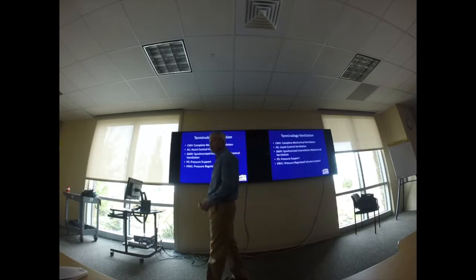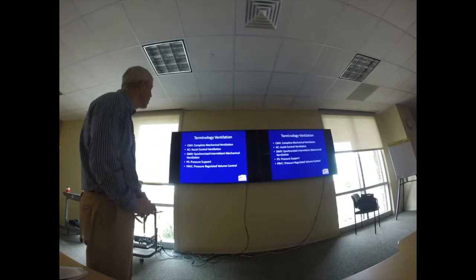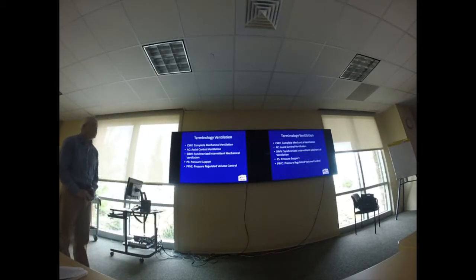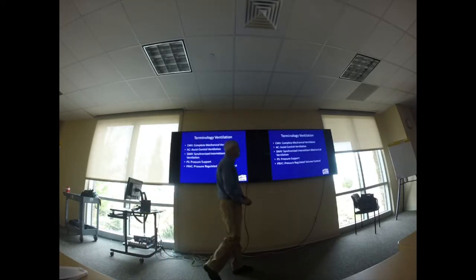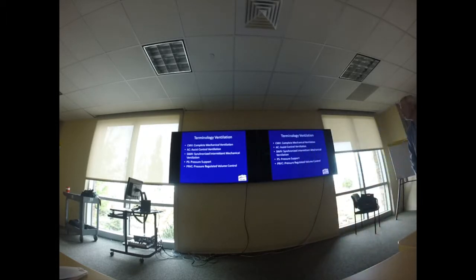We went through volume versus pressure. Now what I want to talk about real quick is some modes of ventilation. The last one is kind of a breath mode, but some modes of ventilation. So CMV is a type of mechanical ventilation that you don't see anymore. It's called complete mechanical ventilation. You don't see it any longer in the ICU. Sometimes you'll see it in the OR, but it takes over all parameters of ventilation. It runs everything for you, and we don't see that very often anymore at all.